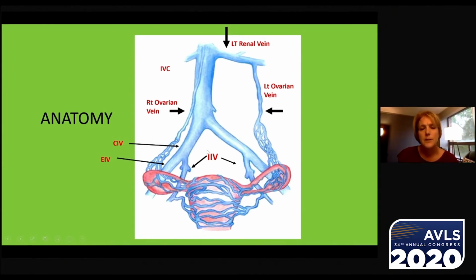Now I wanted to talk about the iliac system. I'm actually going to present a very little piece of the iliacs because Mariah is actually going to give us a longer talk about the iliac veins. And the reason we're doing that is because it's important to realize that the iliac system can be assessed outside of the setting of pelvic venous disease. We want to make sure you realize we can look at it during a pelvic session, but also just to check for compression affecting the lower extremities.